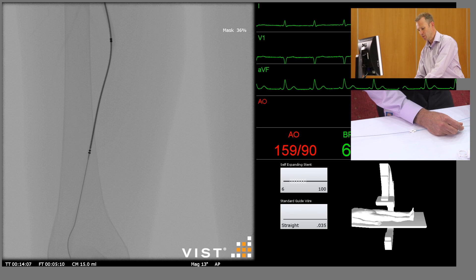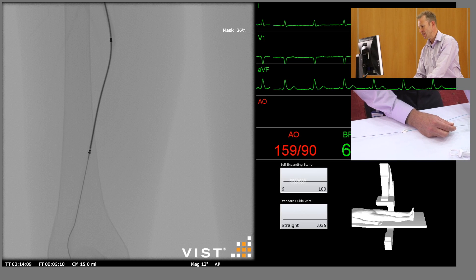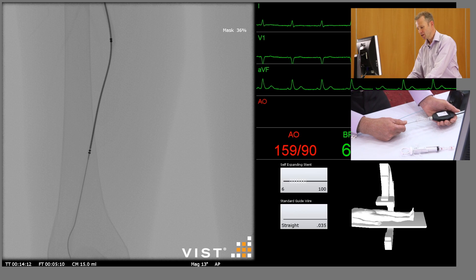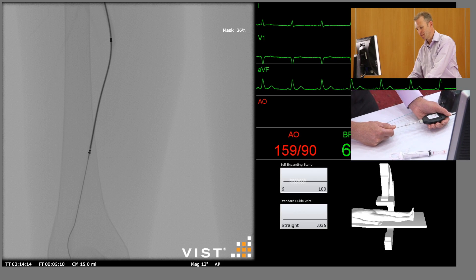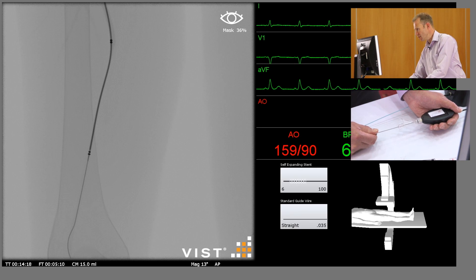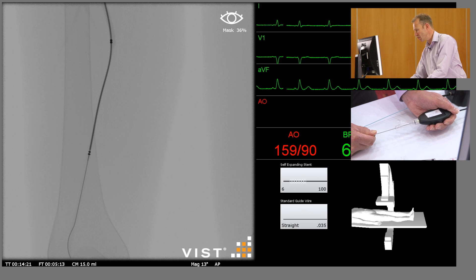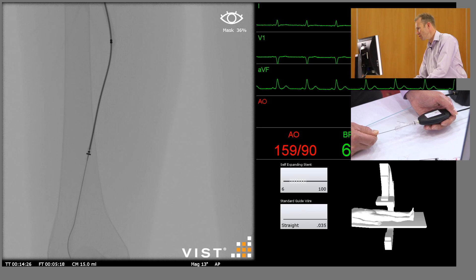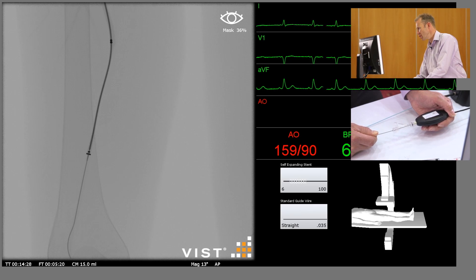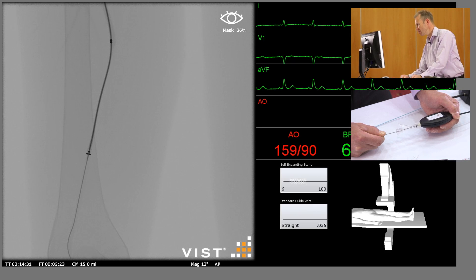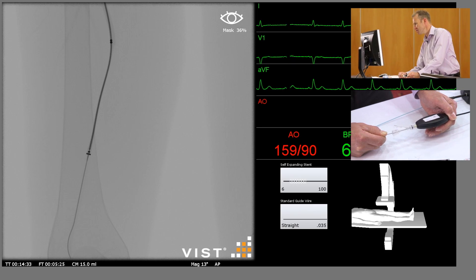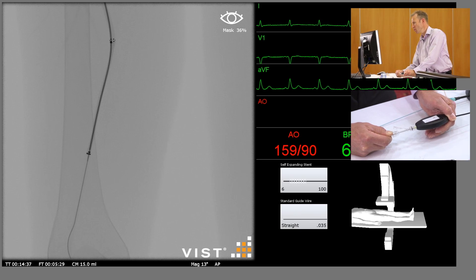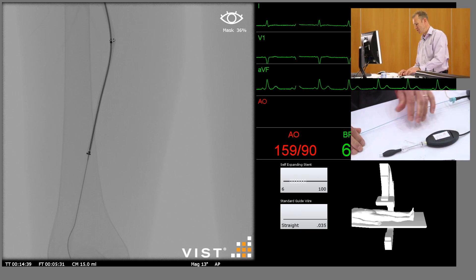At this point we can deploy the stent. All these self-expanding stents are deployed in a similar fashion by fixing the shaft that it's mounted on and then pulling back with your left hand, which uncovers the stent. It's important to do this whilst you're screening to check that the stent isn't walking forwards or being withdrawn. You can see the distal end of the stent has opened up and I'm slowly withdrawing the sheath which is uncovering it. That's the stent now fully deployed.